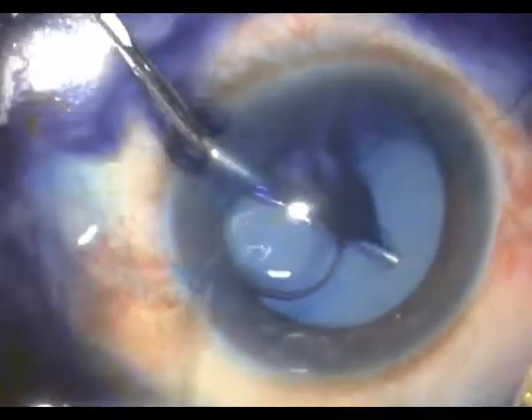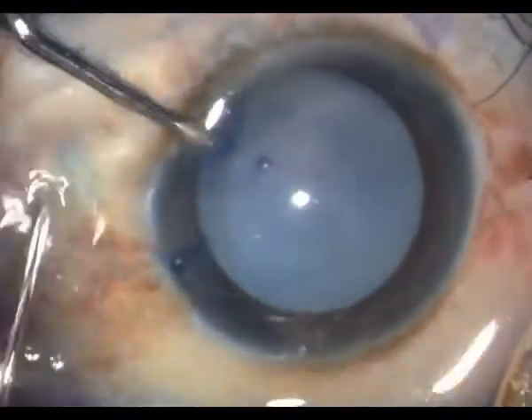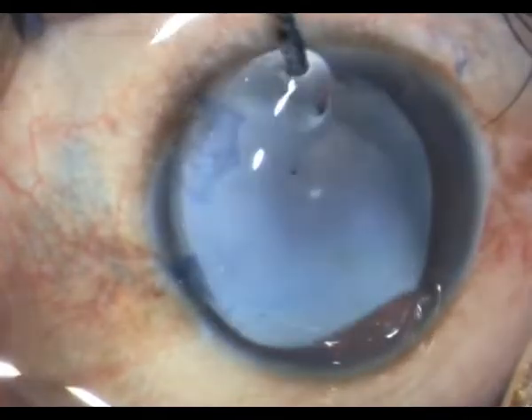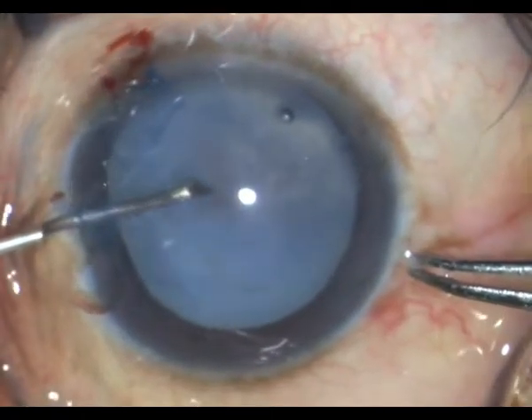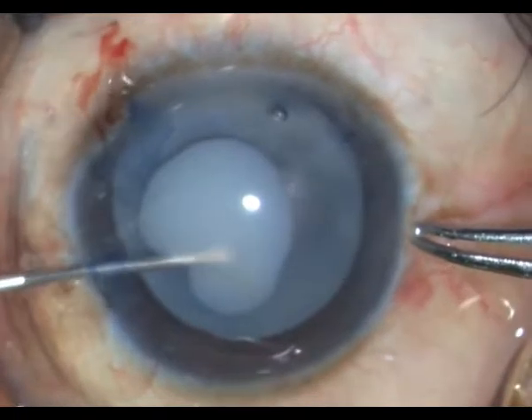I then stain the capsule with trypan blue under air and expel both the air and the trypan blue with viscoelastic OVD. Then with a bent cystitome I go ahead and perform my rhexis.